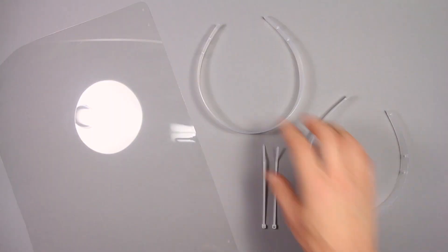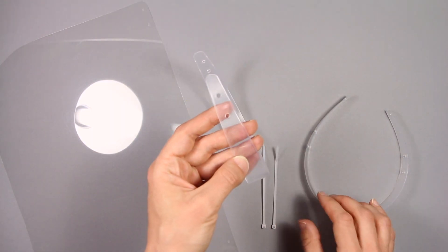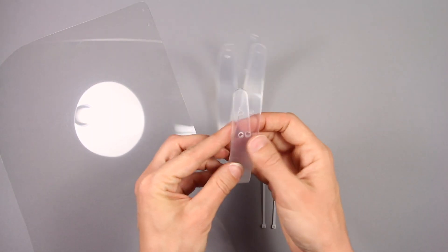This tutorial is for the simple Jersey City face shield design. Place headband A with four holes on the outside of headband B with six holes.